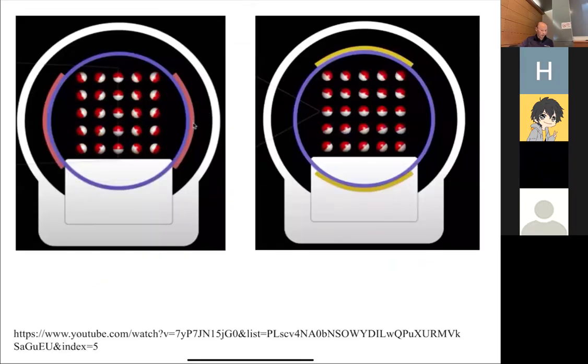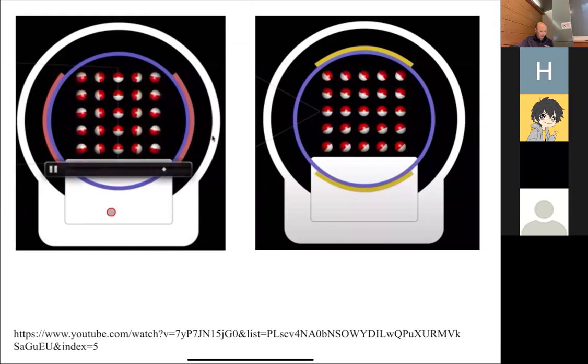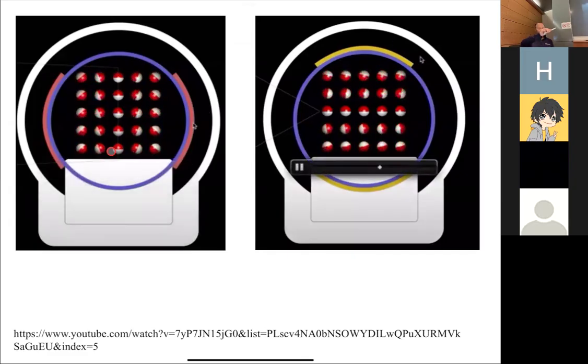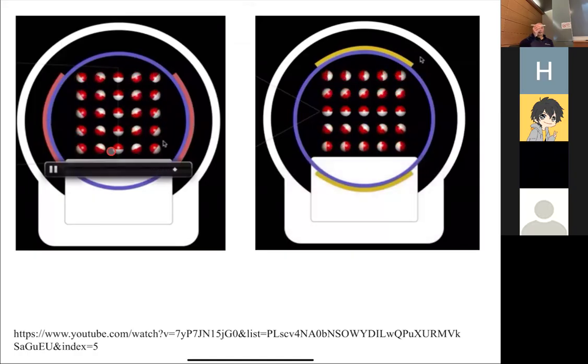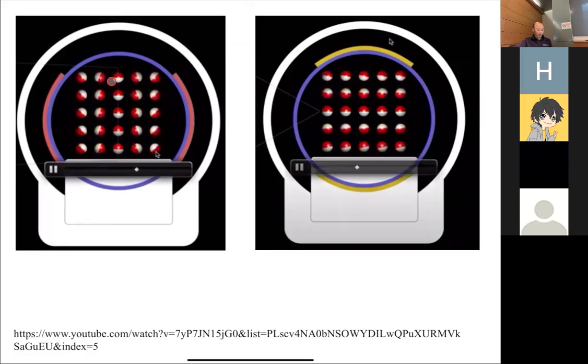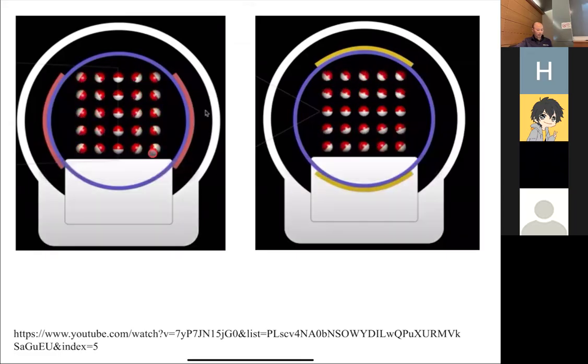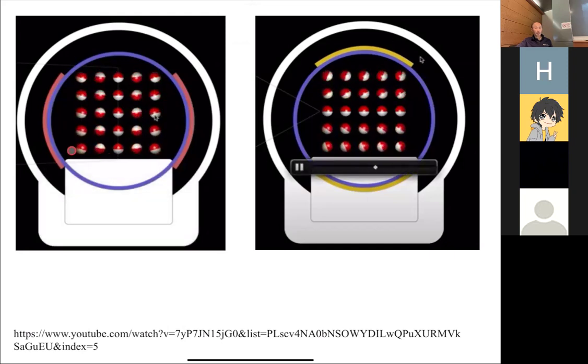Okay, so this is a movie showing that. Let's assume this is the x direction. You can see here that we are now in the rotating frame. Remember, if we're in the laboratory frame, something is precessing; in the rotating frame, it just stays still. So at the isocenter, these stay still, but these spins here are spinning a little faster, and these spins here are spinning a little faster, and then these are going in the opposite direction.